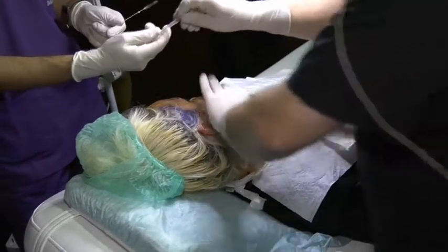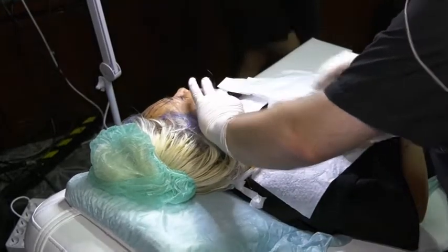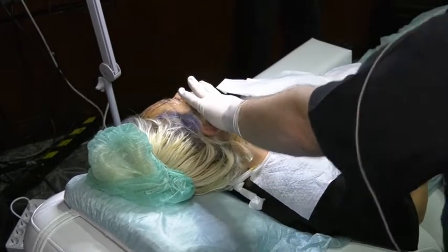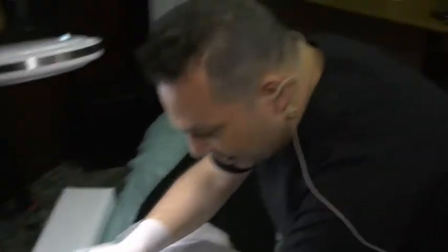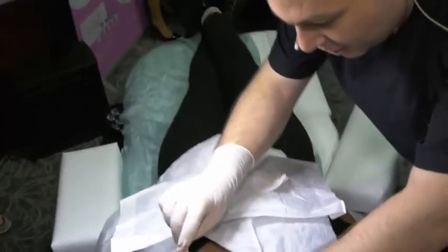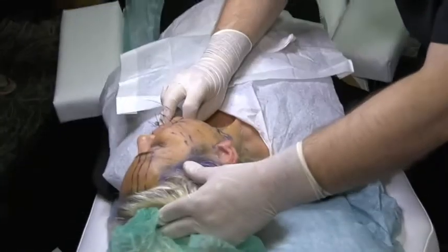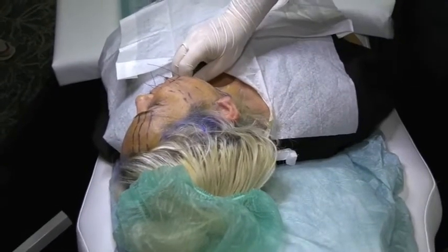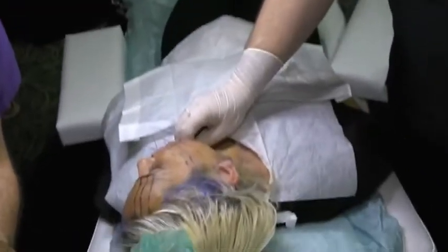Neck one. Look. That's my entry point. You see me? You can lift the skin up like that so you can see. Look. You can see when you pull the skin up like that. You can see the hole. Then you enter into the hole. Then you go subcutaneous. The patient has to flex the neck now. No, this is very difficult now. I cannot see. Understand what I'm doing?